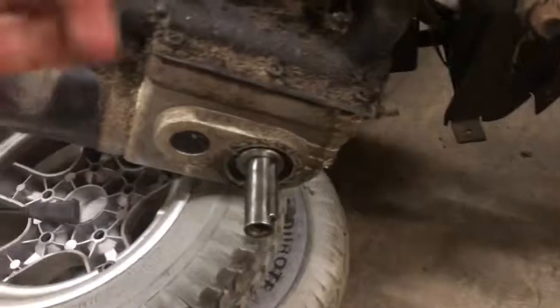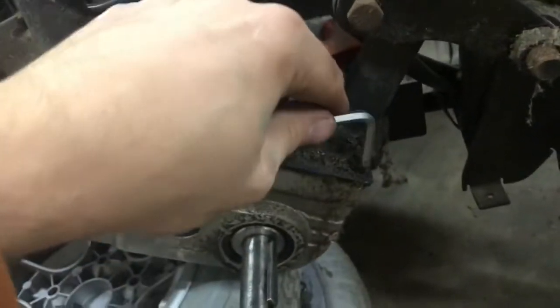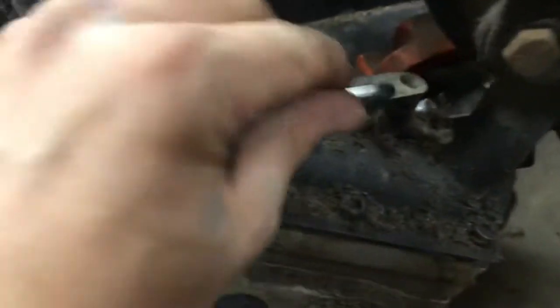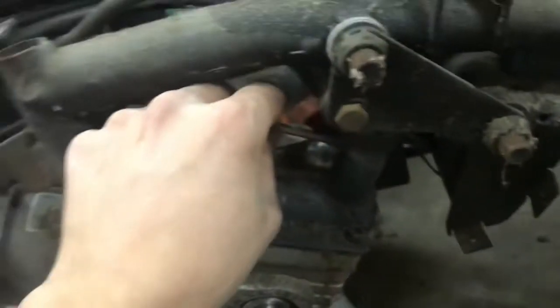There it is. Okay, so now they're a little bit loose. We got a little bit of room on each one of them. So you still want to kind of go along and loosen them still. You want to keep loosening them little by little. There we go. Constantly. This is going to be a little bit tedious. Of course, this last one is definitely going to be the first one you take off. You're going to have to work at it from the inside of the frame. So you're probably going to have to take your batteries out, most likely.